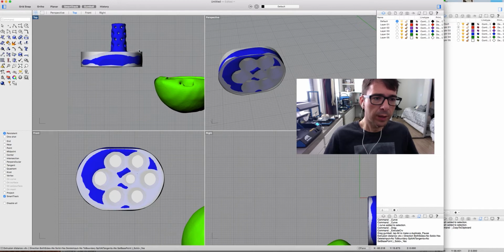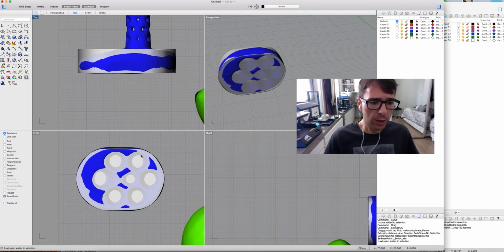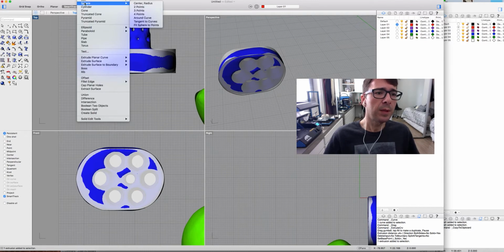Okay, we know that we have some differences here, we're going to cut in the other part of the video. So now we almost have our base plate. Let's design the peg. Okay, let's select here solid, cylinder.